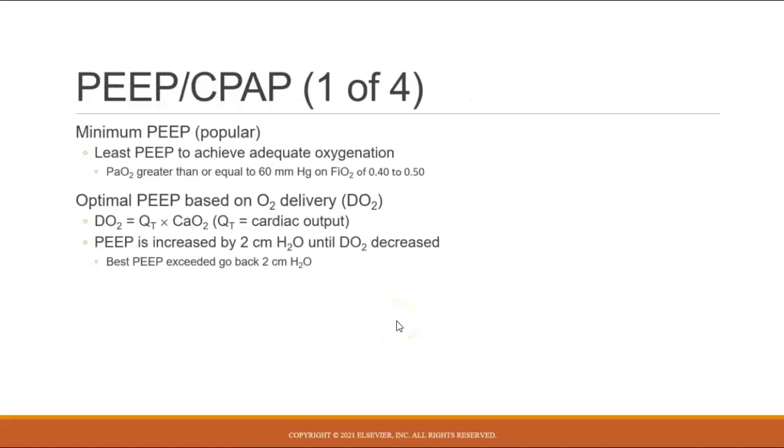All right. So the other setting that's going to impact oxygenation is PEEP. Okay. So we usually look at minimal PEEP, which is the least PEEP that I need to achieve adequate oxygenation. Okay. Or optimal PEEP, which is based on that O2 delivery.